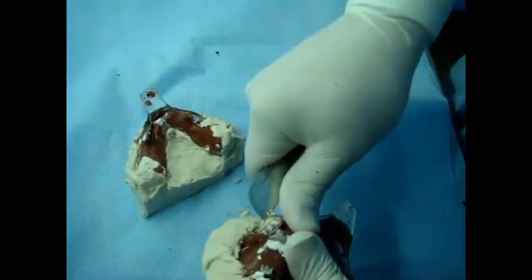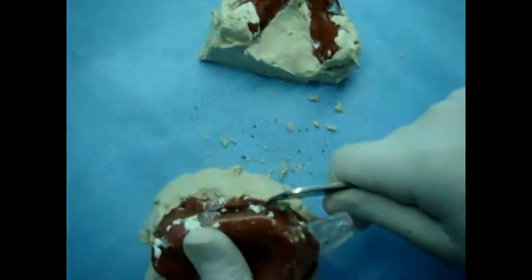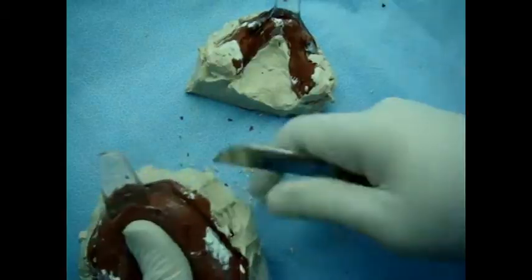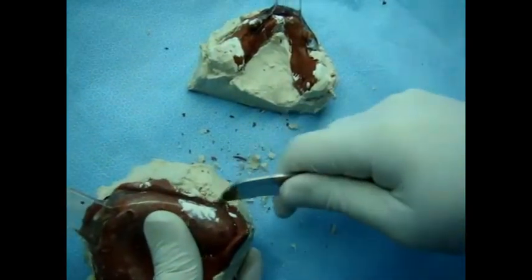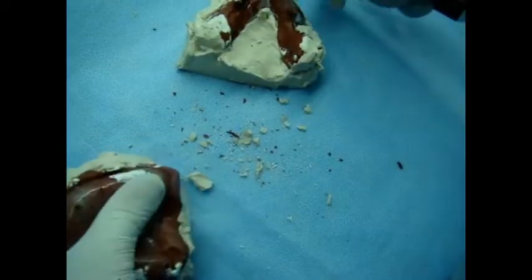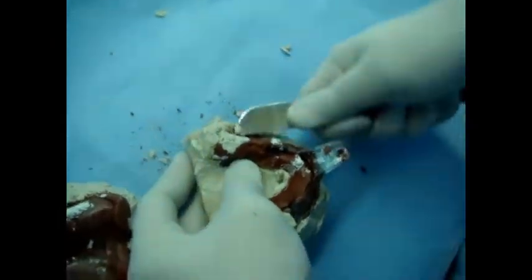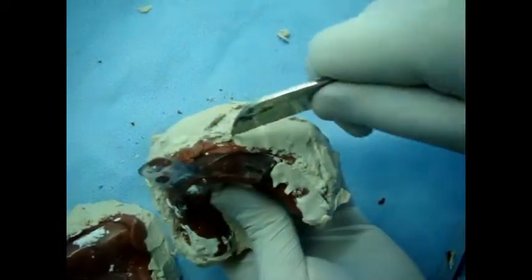Now after 40 minutes all the layers of plaster are fully set. Now we're going to retrieve the impression — to remove the impression from the cast. First we remove the plaster of Paris that covers the tray or the flanges of the impression so we can retrieve the tray with the impression compound.